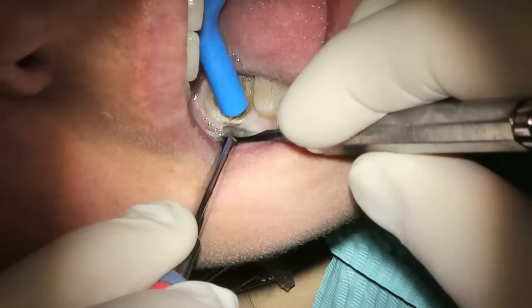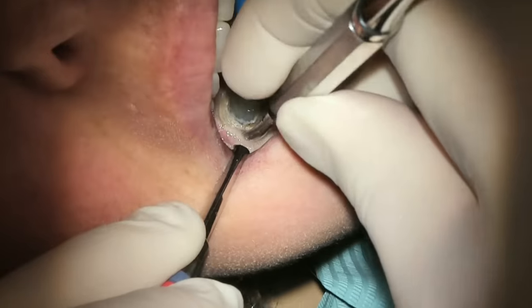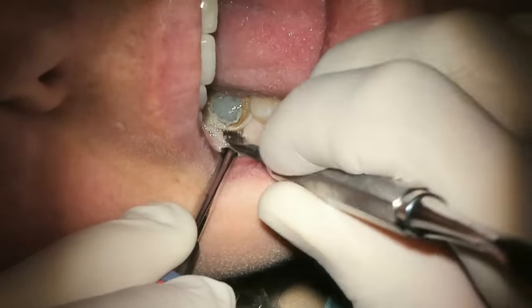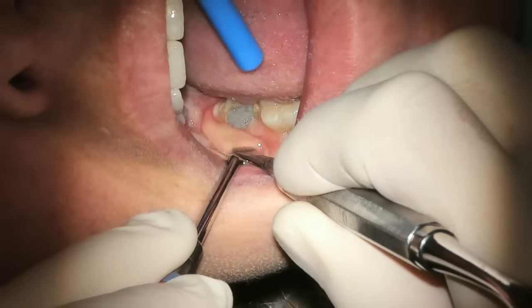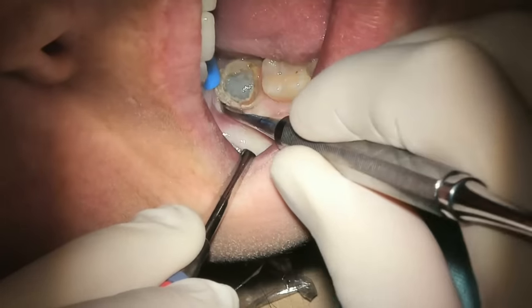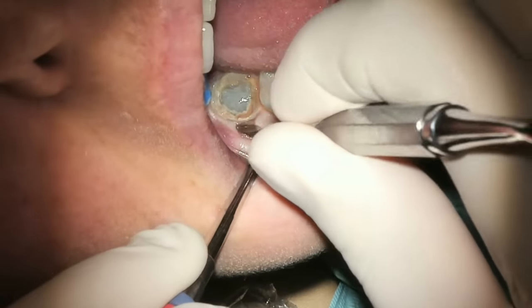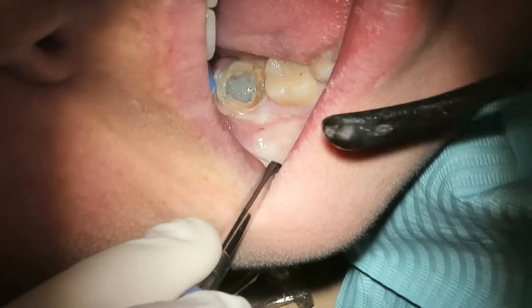Now we start to remove the source of infection, which is this lower right wisdom tooth — deemed non-restorable at this point due to the poor prognosis of the root canal. Pus is actually coming out after we remove the gingival attachment from the tooth. You can actually see purulence or pus coming out, and that's the source of infection occurring there. When an infection occurs, that pus will try to travel in the path of least resistance.